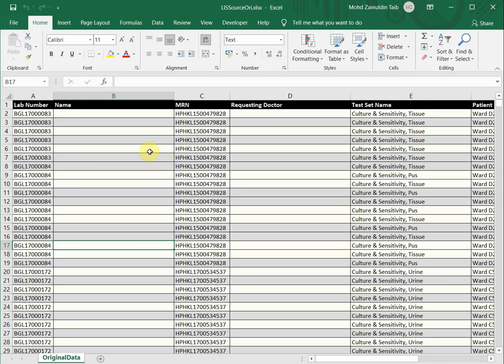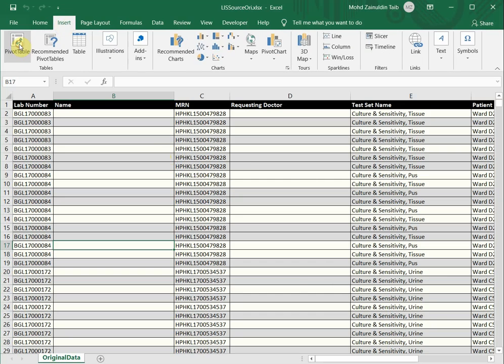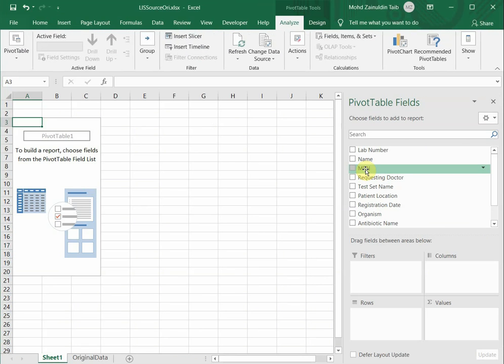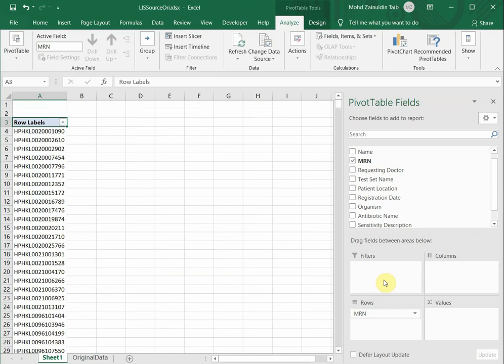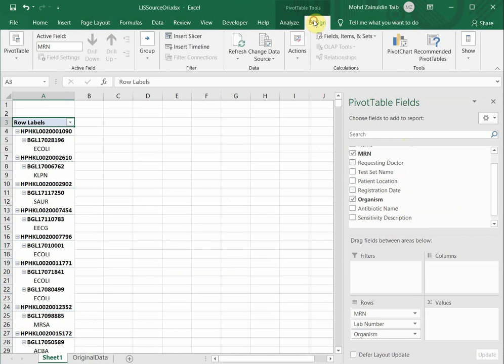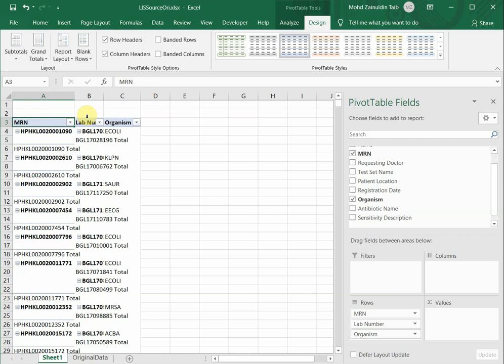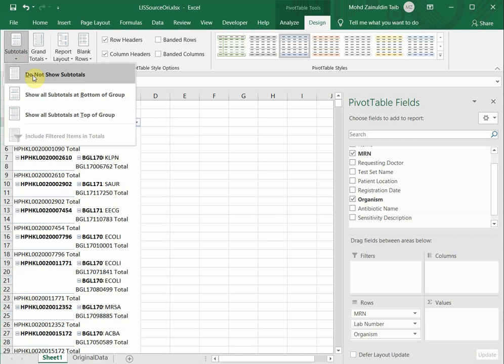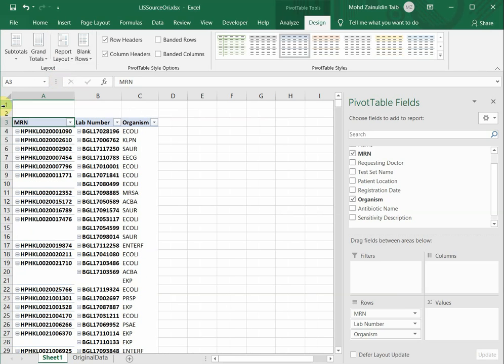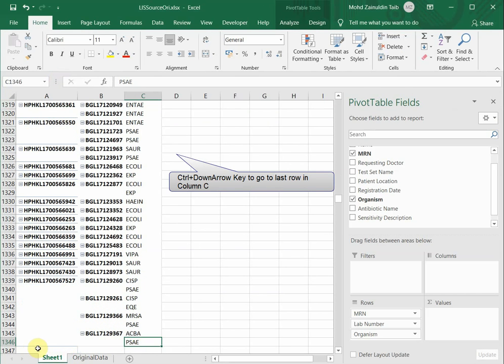I'm going to use pivot tables. Now we go to insert pivot table. I'm going to use this data, in a new worksheet. So now we sort it by patients, MRN. Next, with the lab number for specimen and organisms. We go to the design. We show in tabular form. We remove all the subtotals, and also we remove all the totals. I just remove these 2 blank rows here. The last record is 1346 minus the title, so it should be 1345 records.